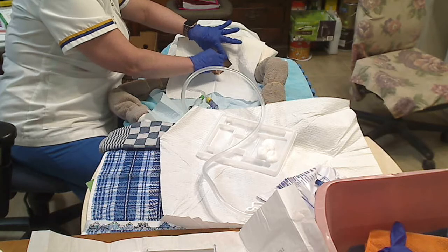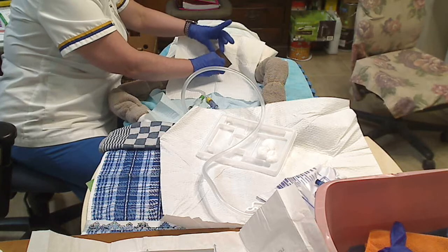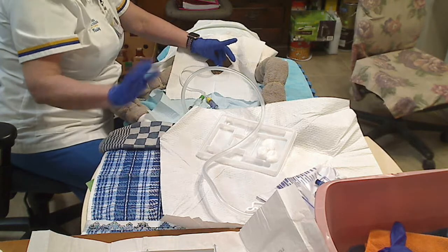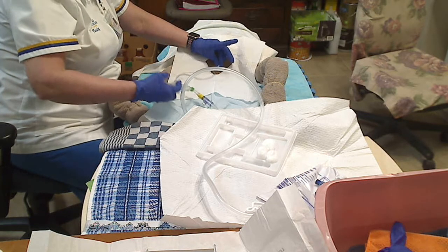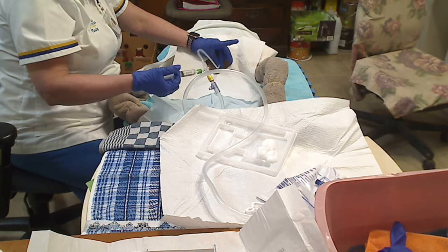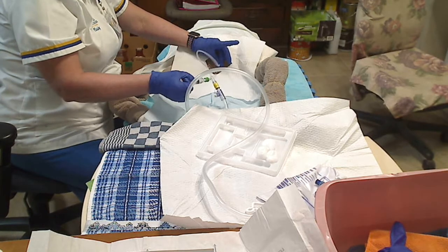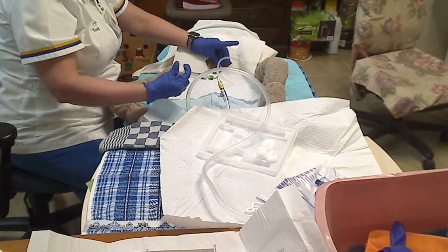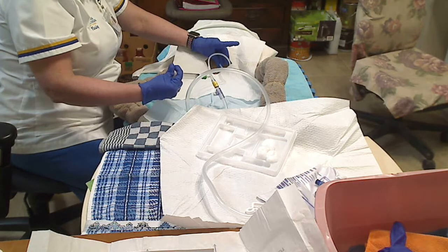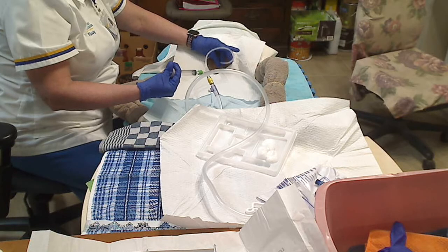From here, I can let go with my non-dominant hand, and I can hold the catheter, and I will use different fingers. I will go ahead with my dominant hand, and I will press in the 10 milliliters of sterile solution so that it inflates the balloon, keeping it placed within her bladder. If I felt any resistance at all, I would stop right here, but everything is flowing properly. Since it has a tendency to want to back up, what I need to do is leave my hand on the plunger so that I can properly remove the syringe.